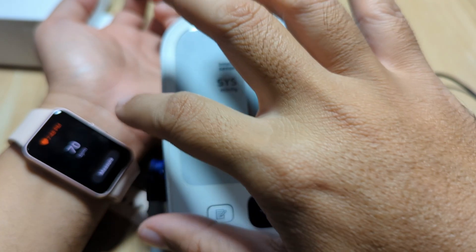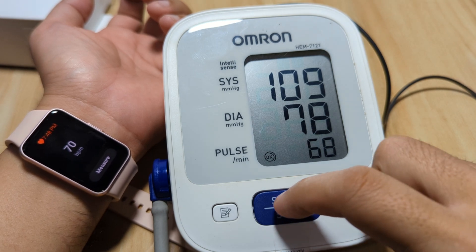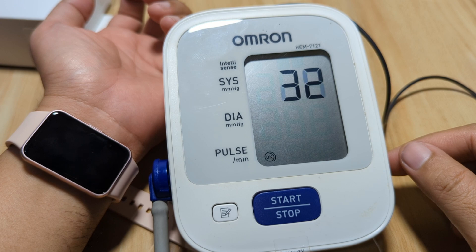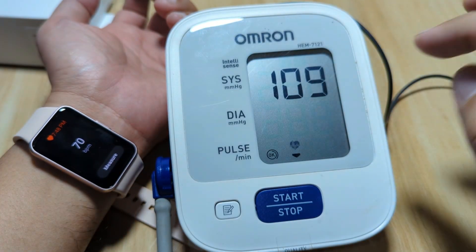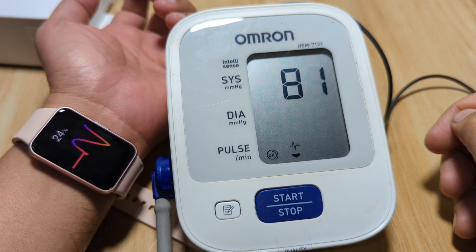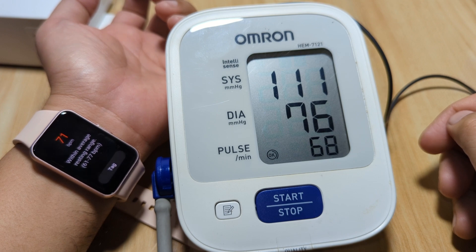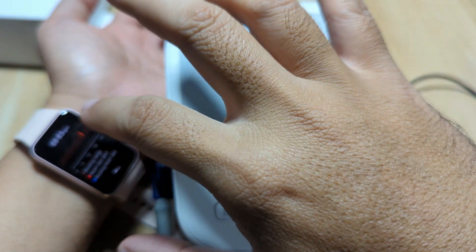Let's have another one. We will measure at least 3 times just to make sure. We'll start measuring at 100. Now checking — 68 on the Omron and we have here 71 on the Galaxy Fit 3. So plus 3. Very close — the result is very close.